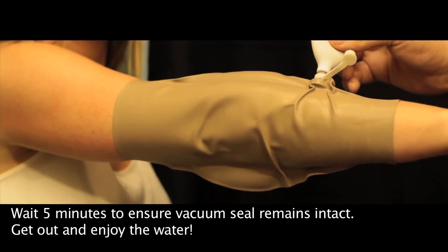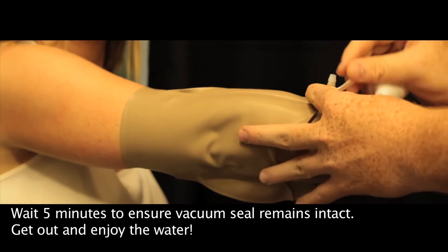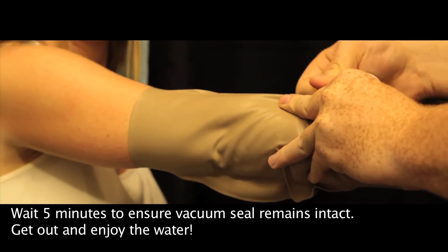Now wait about five minutes and make sure the vacuum seal has been set. Now you're ready to go out and get wet.